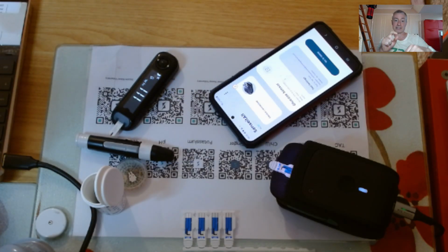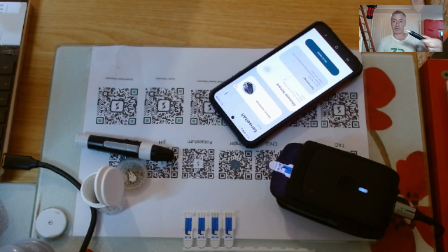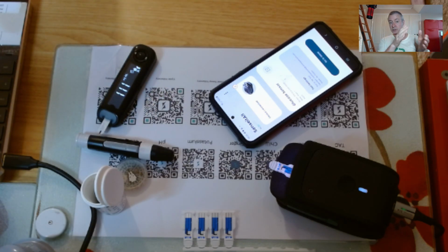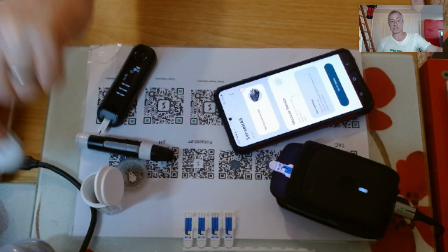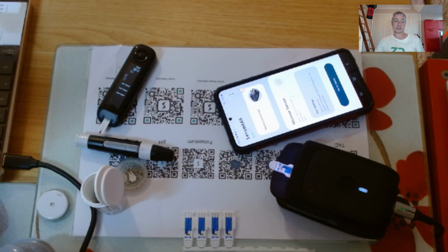What you then do is actually program this to say, at this moment, my blood glucose is 111 milligrams per dL. So you can understand that's a single point calibration. And then you do that a few hours later, and then it would basically start using those single point calibrations to essentially calibrate this. Because what you end up doing is calibrating between the signal on the watch and what your blood glucose really is. And if you do that a few times, then you can essentially end up doing, let's say, an in vivo calibration. It sounds crazy, but that's actually how, when Abbott first went to market with something like this, that's exactly what they were doing. They would get finger prick tests during the first 24 hours.